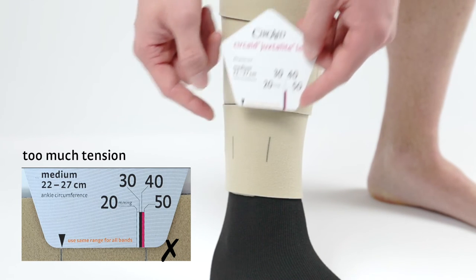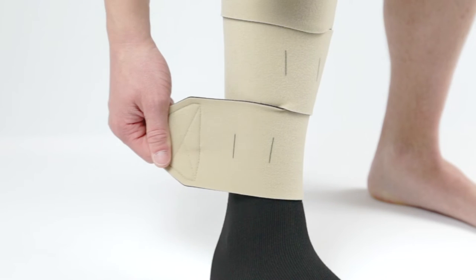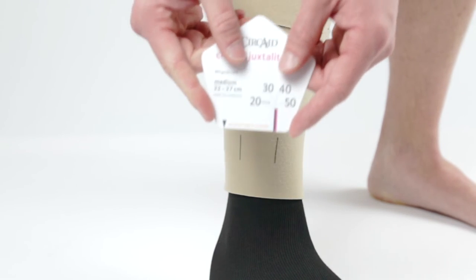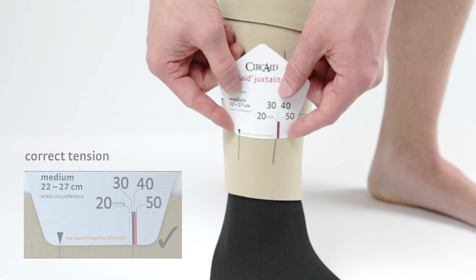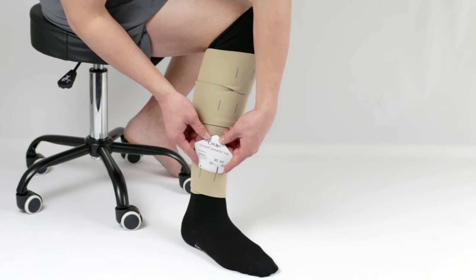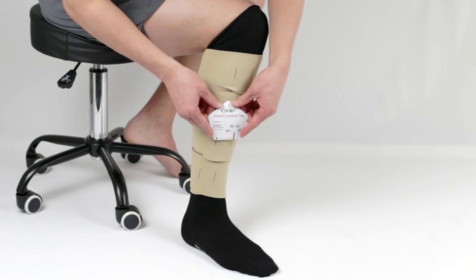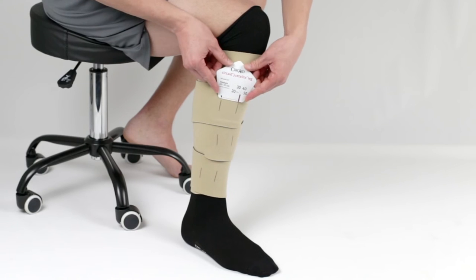If less compression is needed, completely loosen the band and refasten it with less tension. Repeat this process with each band going up the leg. Make sure to adjust each band to the same level of tension. Readjust the bands as needed throughout the day to provide firm and comfortable compression.